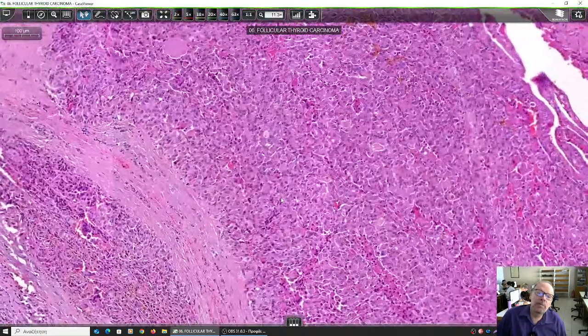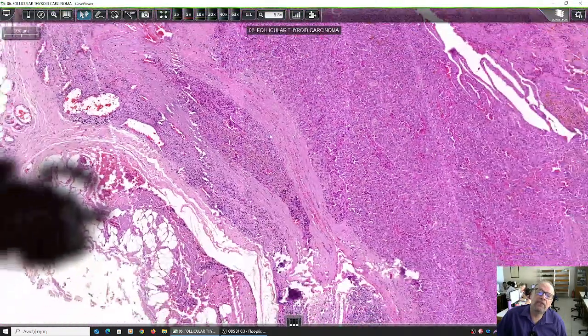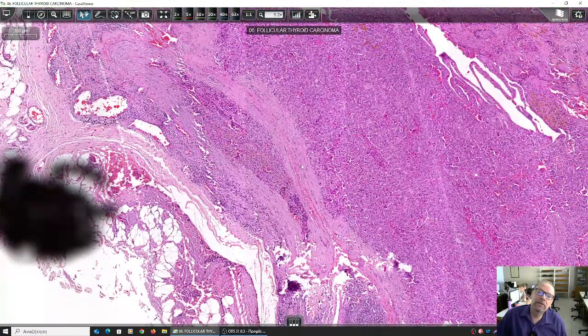And here we might have a population of follicular cells within which part? Because this being a follicular neoplasm, it should have a thick capsule, like the adenoma. However, we see cells within this thick capsule, so this might raise suspicion of invasion.